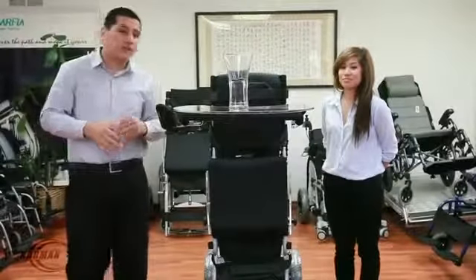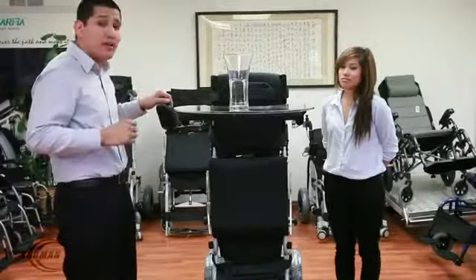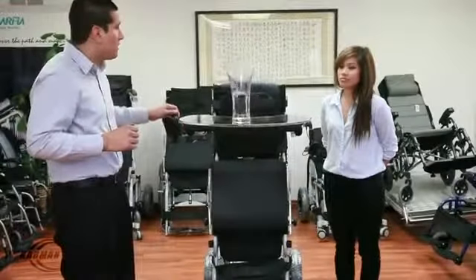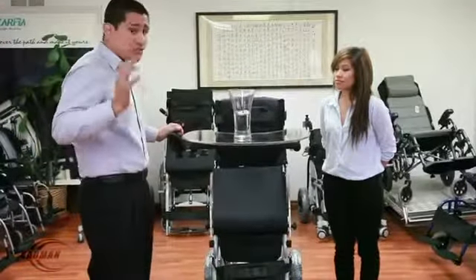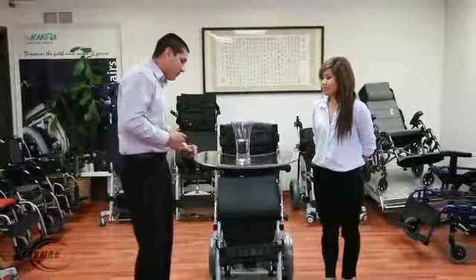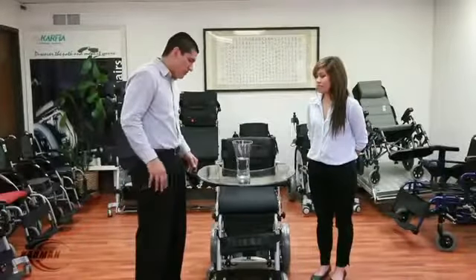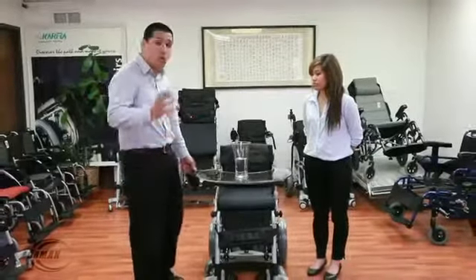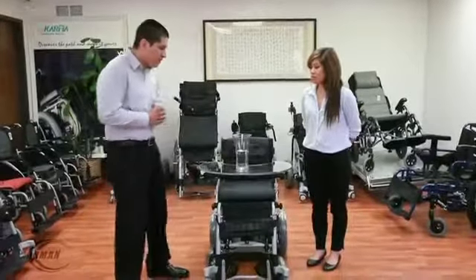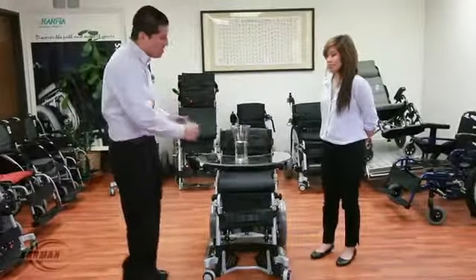This is the fully standing position. I'm going to lower the chair again and show you how safe and sturdy it is. In just 14 seconds, this chair goes from a standing to a sitting position. Now, this tray is removable — it's transparent, clean, and washable. In 14 seconds, it goes from a standing position to a sitting position.